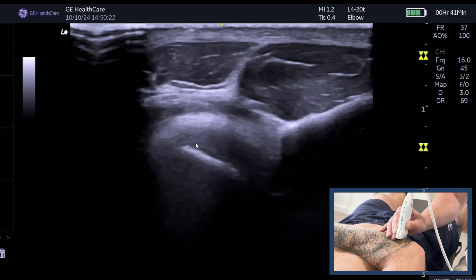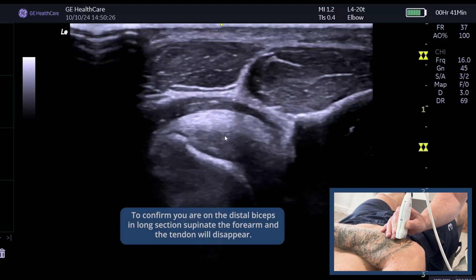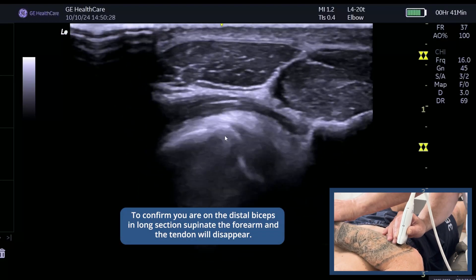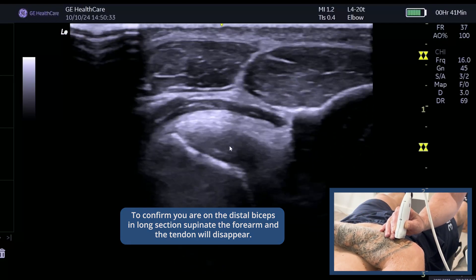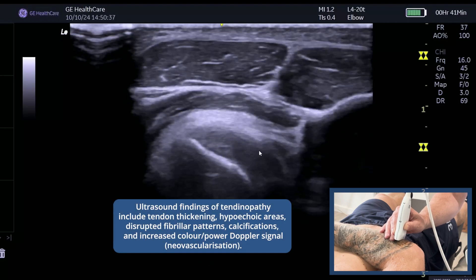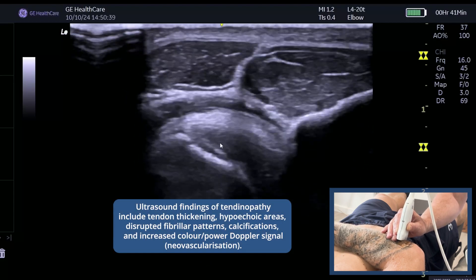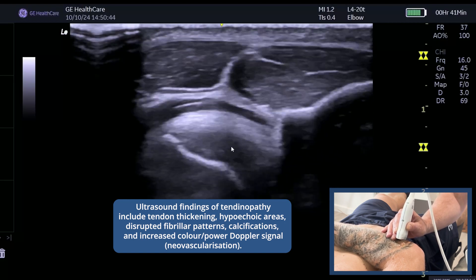Here you can see a long section of the distal biceps. If you're not sure you're on it, ask your patient to supinate — it will disappear and then come back up. This is the radial tuberosity. You can look for any thickening; this one is actually quite thick and slightly heterogeneous, showing a slight loss of fibrillar pattern, but nothing to be too concerned about.